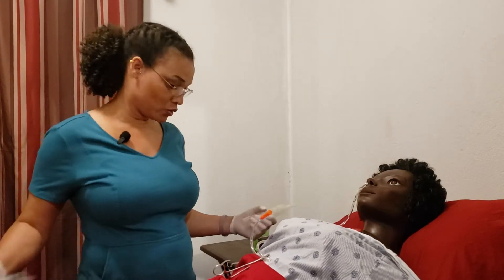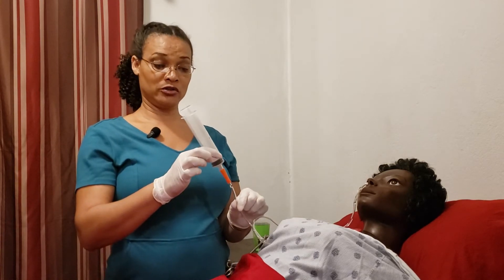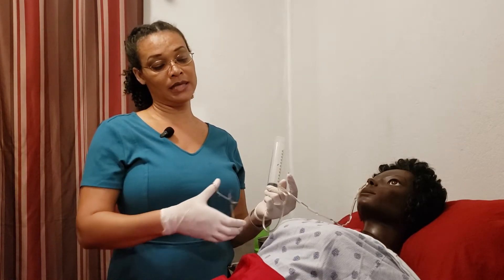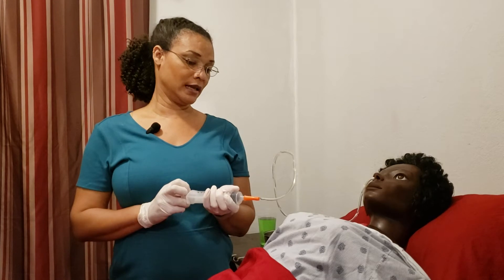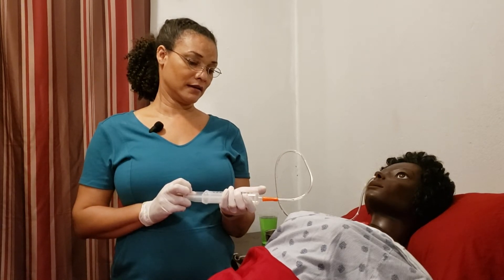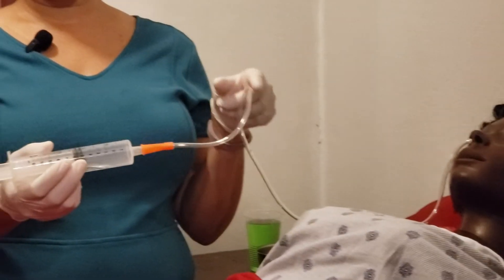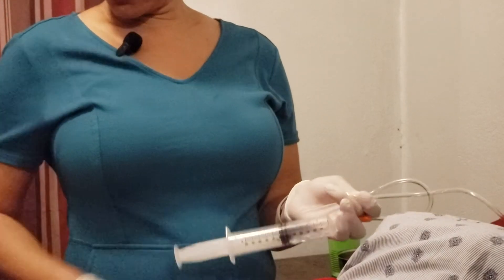What we are going to do is aspirate first. We attach our syringe, create a bend in the tube so we can release and then aspirate slowly to get back the content. After you've gotten back the content, remember we are trying not to get air into the tube, so we then clamp it off.